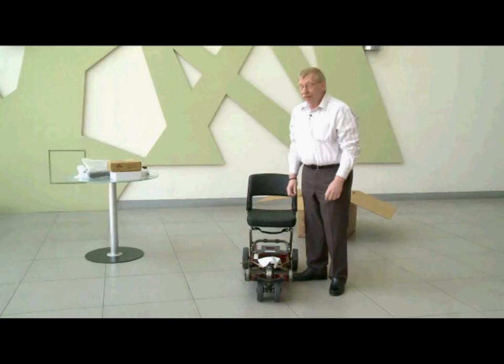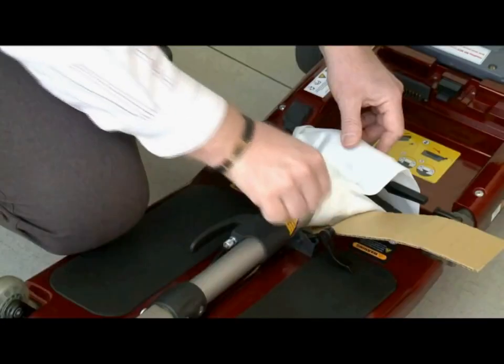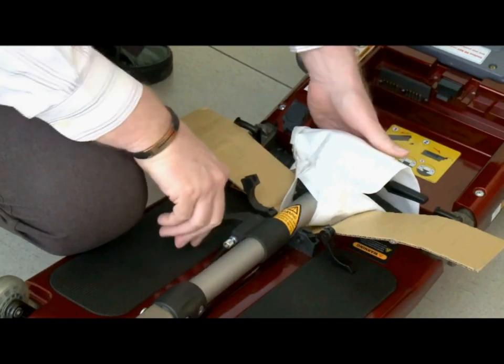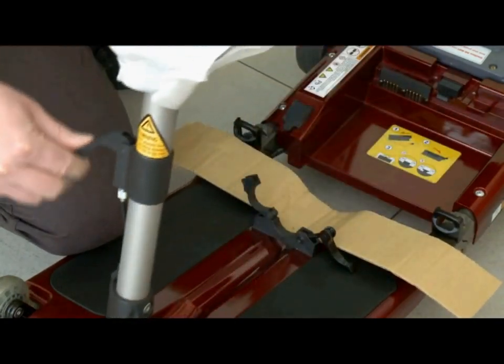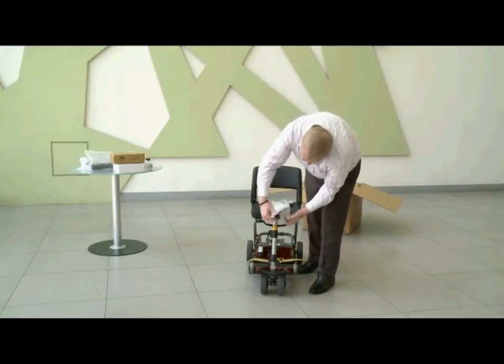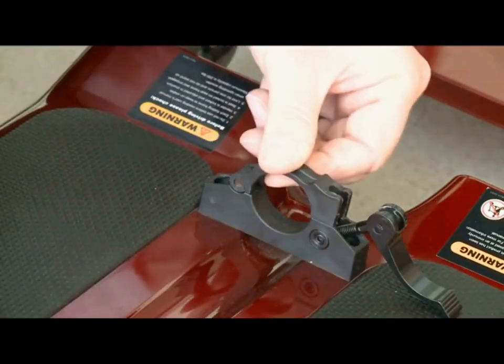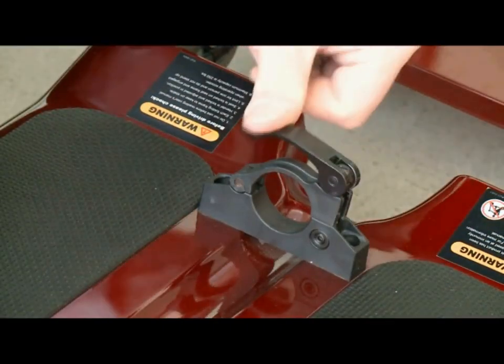Now you want to lift up the handlebar and that's quite easy. The first thing you do is open up the clamp and then pull this lever on the side. That will allow you to lift up the handlebars like so. Remove this protective material and the cardboard, and then don't forget to close the clamp again.